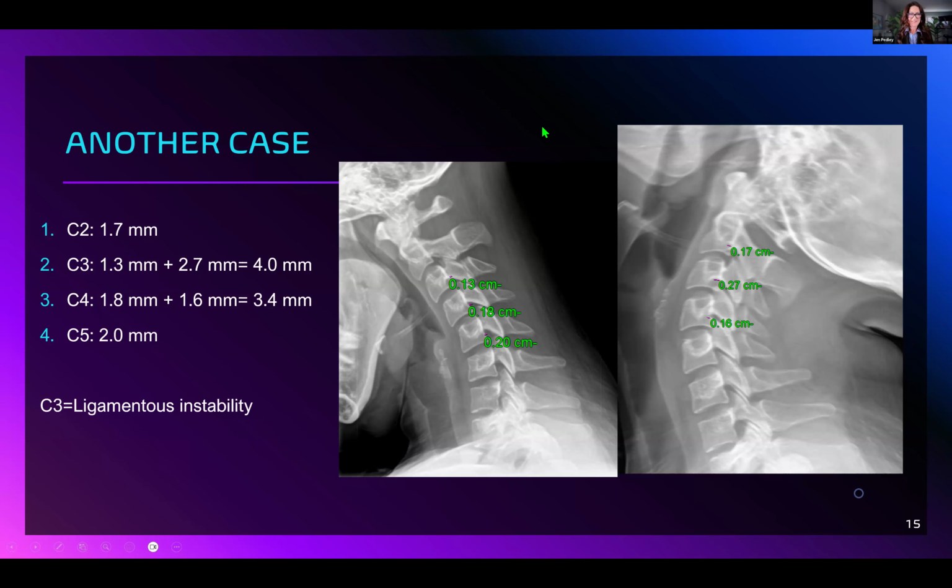Yes, absolutely. Interesting. Okay, good to know. And on these x-rays I showed here, the atlantodental interspace has been normal. If we see widening, we would typically see increased widening with flexion, because that is a stress radiograph for that particular region. So in the x-rays that I have shown so far, the atlantodental interspace has been normal.